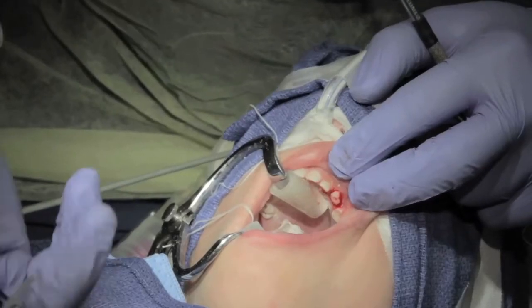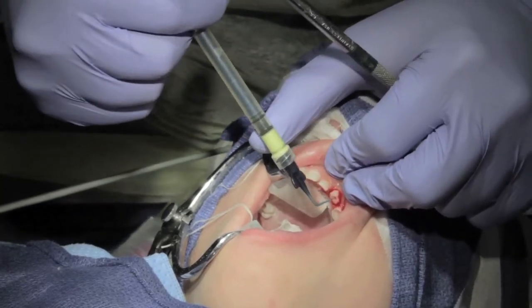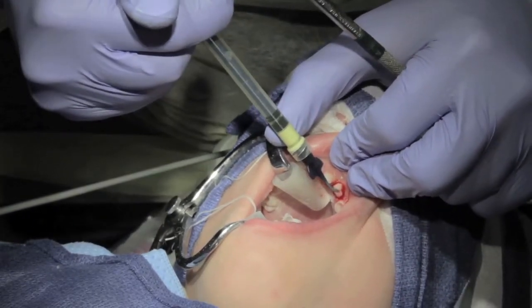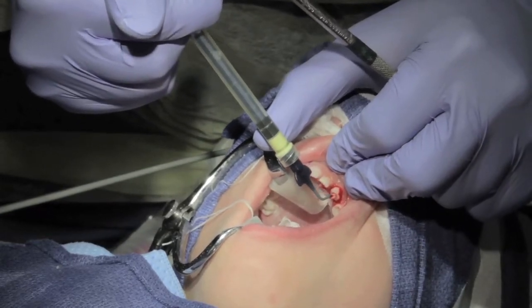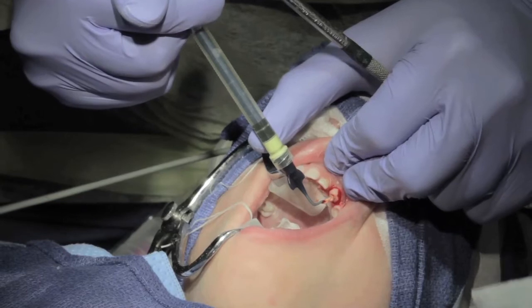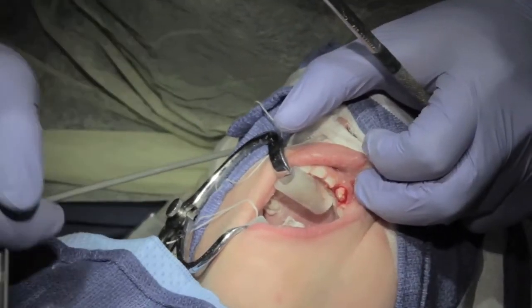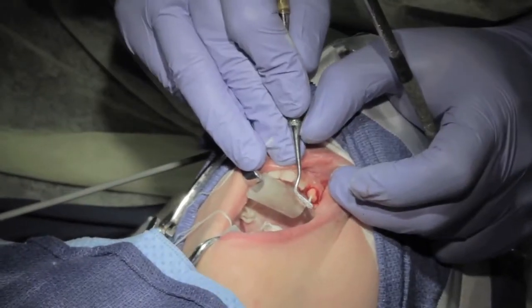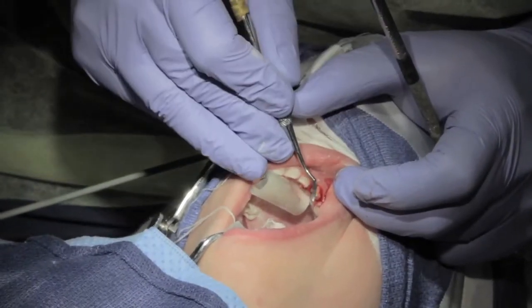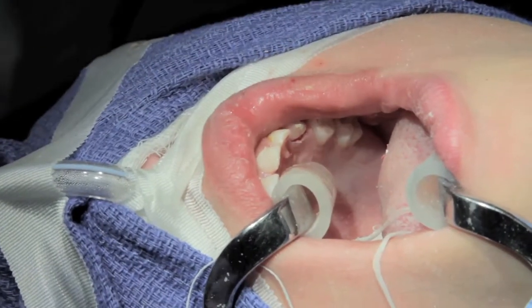I use Vitapex, which is an injectable filling material. It's nice because you can put it to the apex, and as you squeeze you retract, getting a nice perfect fill every time. Because it washes away a little more easily than regular ZOE, I like to cap it off — gives it a little more sturdiness.